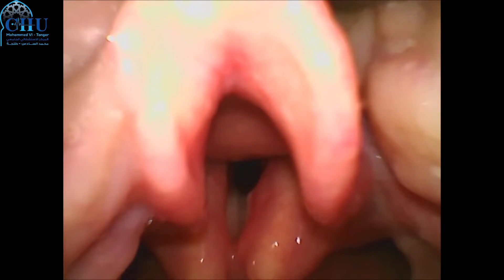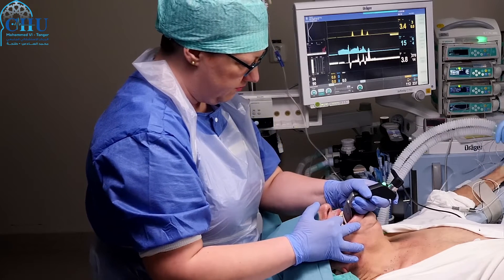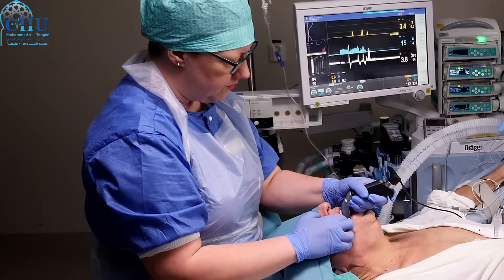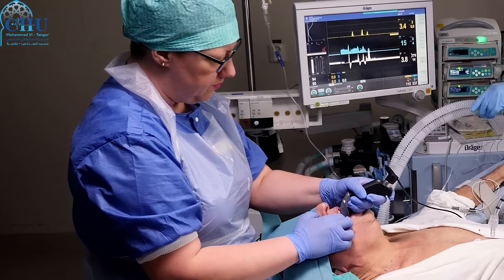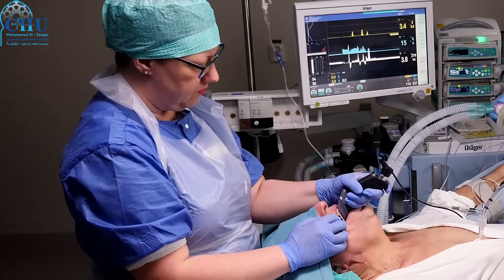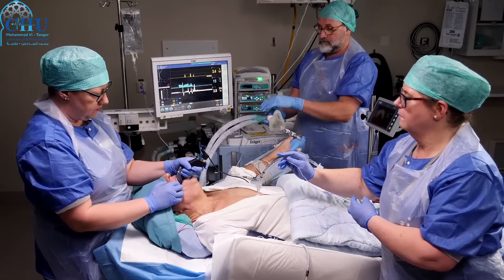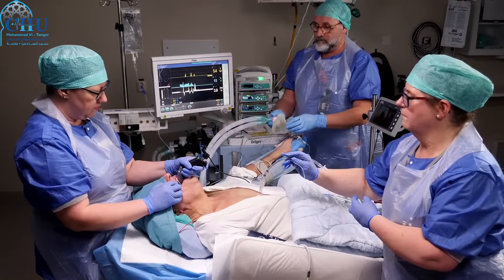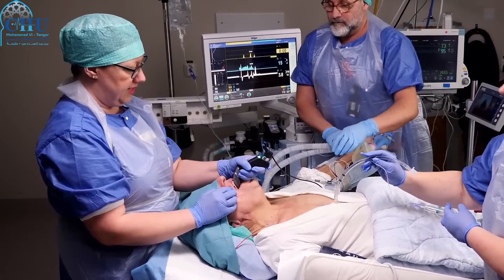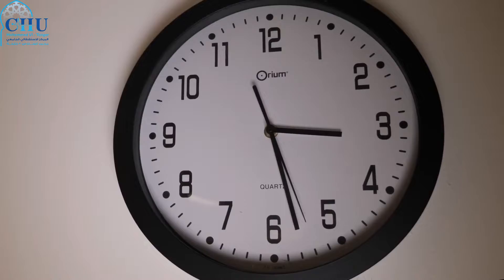A common mistake at this point is leaning forward, as it feels this will give a better view — it doesn't. Stand upright with the left arm at a 90-degree angle, tucked in towards your body. This allows for better ergonomics, better communication with the team, and a better overview of the ventilator, the timer, and the patient.